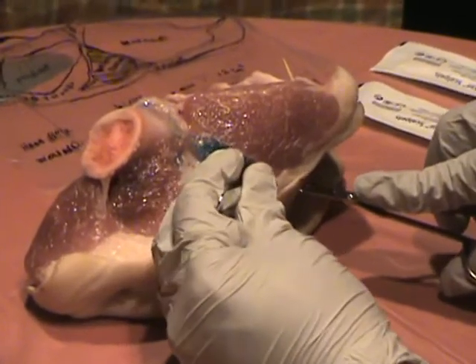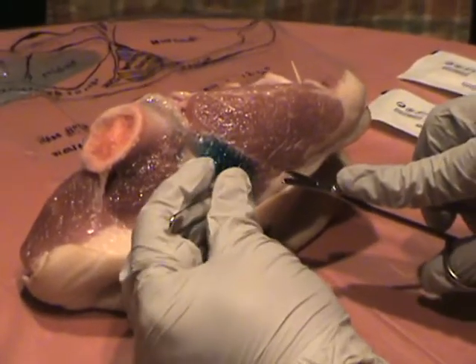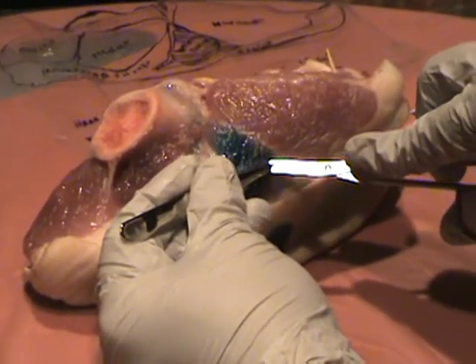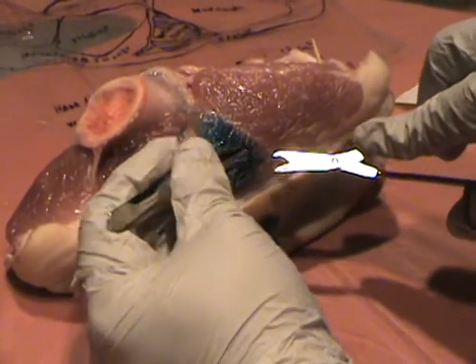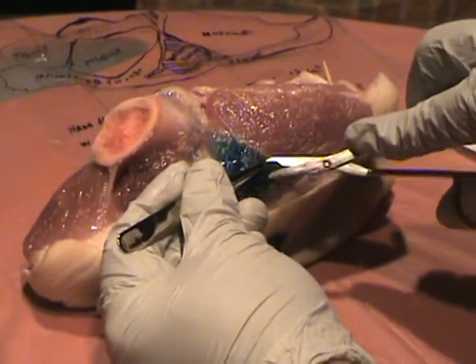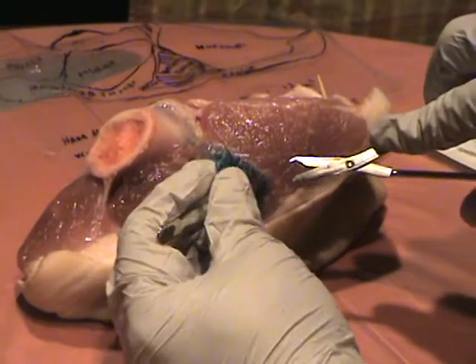So I'm going to be taking some piece from the blue necrotic tissue. I'm only going to be cutting the blue dye and try to stay away from the viable tissue.